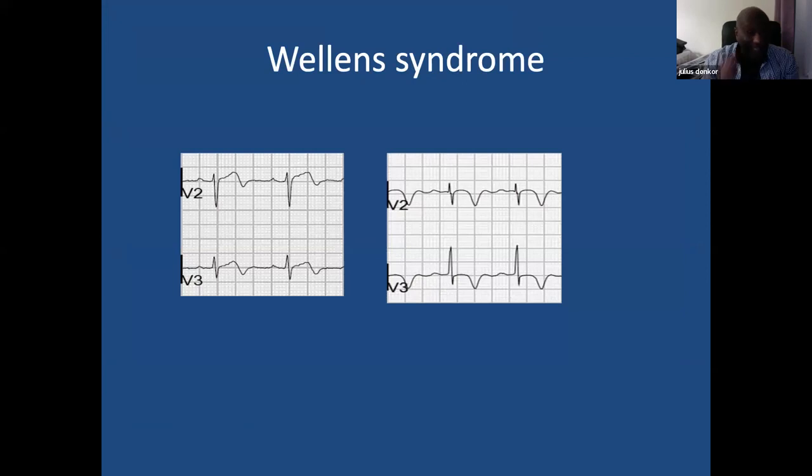Different types of T wave. A lot of African, Afro-Caribbean females might have T wave inversion from V1 to V3. So again, there are different group variations as well, to make it complicated. I can actually do a presentation on that because it's really useful for the differential diagnosis of benign early repolarization, MI, and also pericarditis.